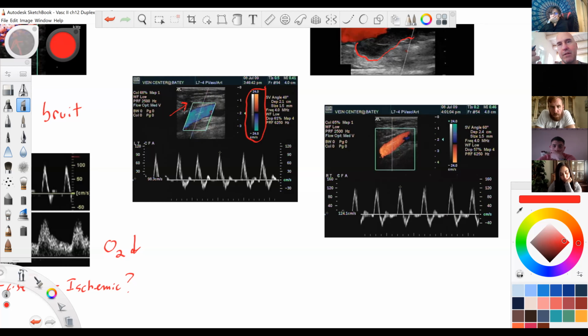They stopped, they hit freeze, or they switched from color to spectral right there. They just chose the exact wrong time to hit the freeze button or to switch from one mode to the other. And so the flow is going backwards because, yeah, red is towards the camera.